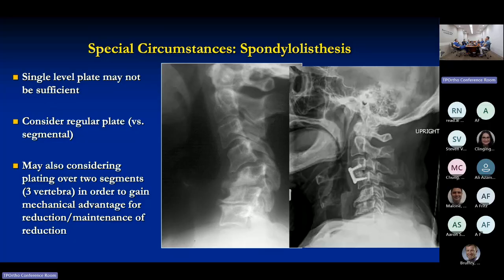I will say, I think most of us, and Kevin, I've talked to you about this too, are using more cervical pedicle screws now when we have navigation. So it's definitely a more common thing to do. You can look at your anatomy ahead of time too. Although a lot of these patients that have these crazy spondys have crappy dysmorphic pedicles, and you think, I'm not risking that. But just be aware that's another tool. If you look at it and this patient's giving you some pedicles that could be good. Usually the bad actors are upper cervical, C3, 4, C4, 5, where pedicles are not typically useful.